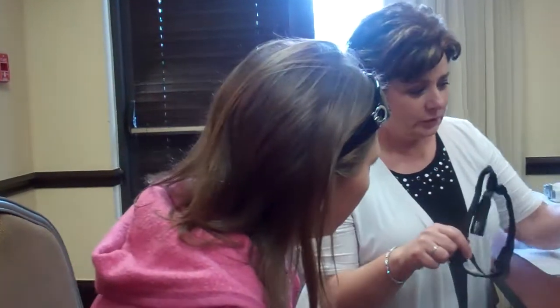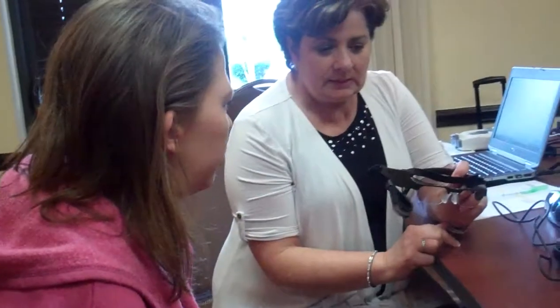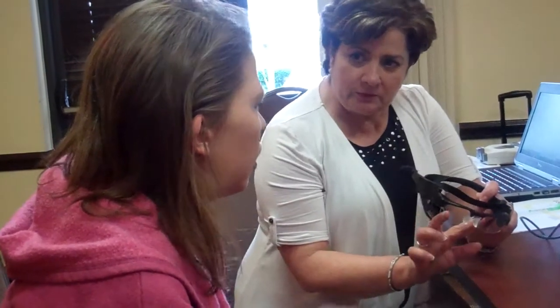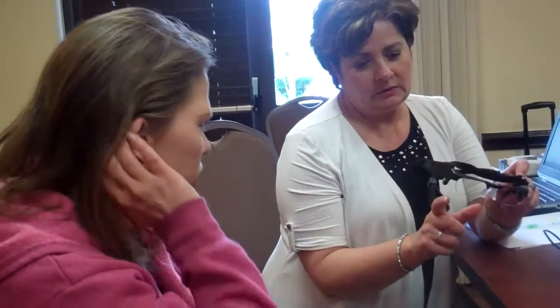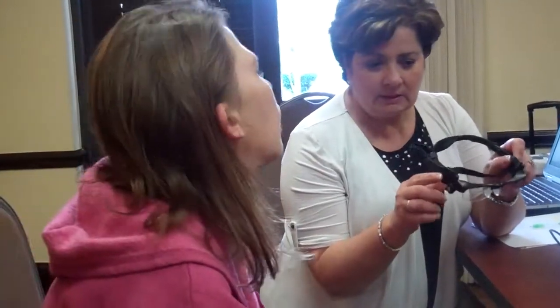So I'll just go over what eSight is all about first. There are three pieces to the eSight. The first piece is the spectacle portion of the glasses. This is where we would put your prescription for distance if you had one. Do you wear glasses at all? No. Okay, so these are just plain lenses, and the reason we use plain versus nothing is it provides stability to the frame itself.